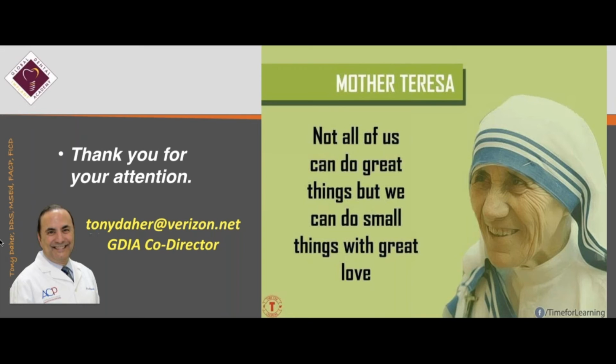But remember, the first choice, if the patient has a good bone and good ridge, is to make a fixed bridge, fixed prosthesis. And then you can downgrade it according to the time available for the patient for the treatment and also for the money that the patient has. A U shape is the same thing. I know that in some books they make a difference on the number of implants according to the shape of the ridge and so on.